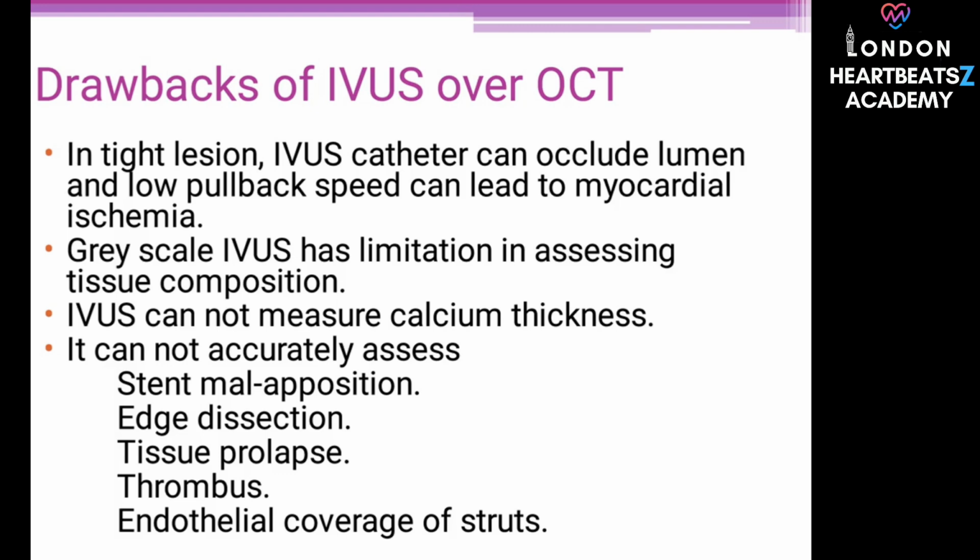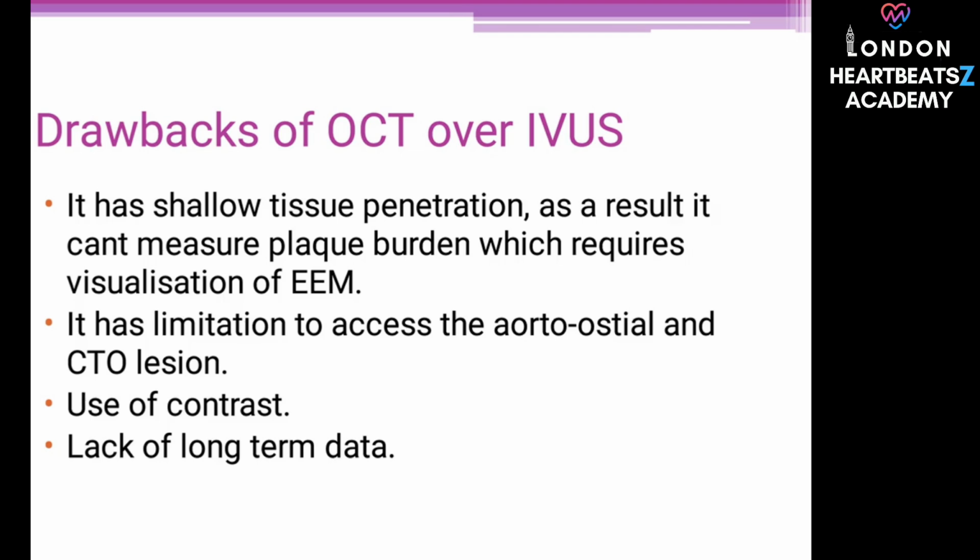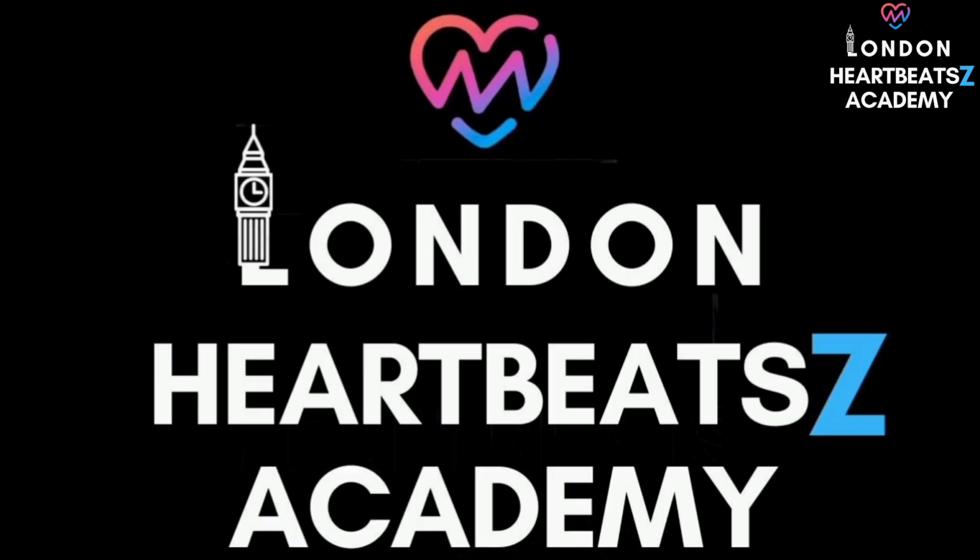This has been an absolutely fascinating and incredibly detailed deep dive into the intricate world inside our arteries. We've covered a tremendous amount of ground today, from the fundamental principles behind intravascular ultrasound and optical coherence tomography to their diverse and advanced applications, and we've explored the evidence from key clinical trials. It's truly remarkable. Indeed, it has been comprehensive. We saw how IVUS pioneered the inside look, giving vital info on vessel size and plaque burden. Then OCT built on that with near-microscopic resolution, revealing critical details about plaque composition and intervention results. Seeing the evolution. Both play significant evolving roles in understanding heart disease and guiding more precise treatments.